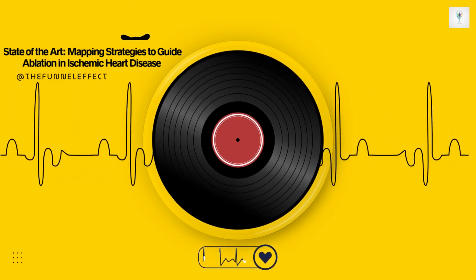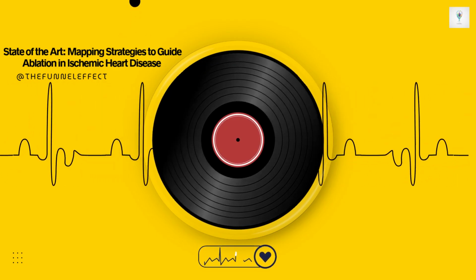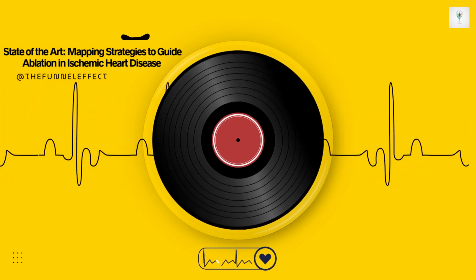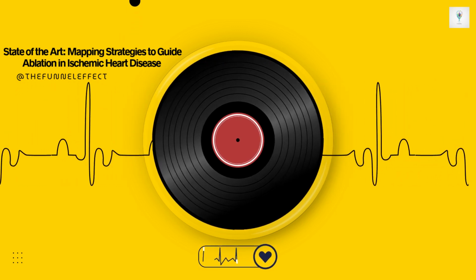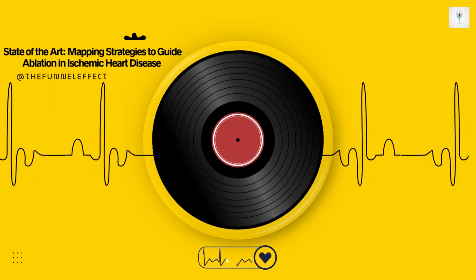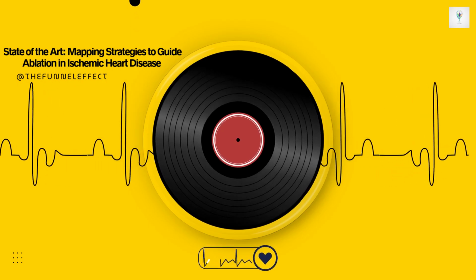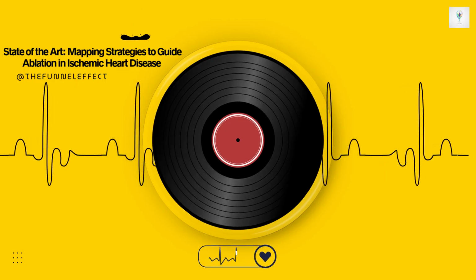Okay, that makes sense. And this leads us right into the main distinction the review makes. There are two really broad approaches, often used together. Let's start with the one that seems focused on stability first. Substrate mapping. Right. Substrate mapping, that's the first big pillar. We do this while the patient's heart is stable, either in its normal sinus rhythm, or maybe we're pacing it steadily. We're essentially mapping the potential for trouble, looking for the electrical warning signs, areas of low voltage, signs of slow conduction that tell us, hey, the architecture for VT exists here, even if the VT isn't actually happening right then. So you map the danger zones while things are calm?